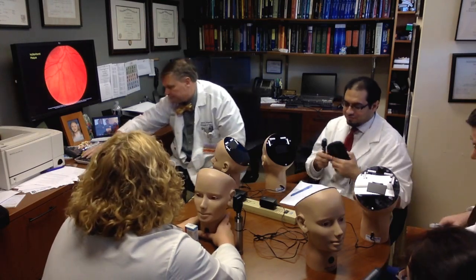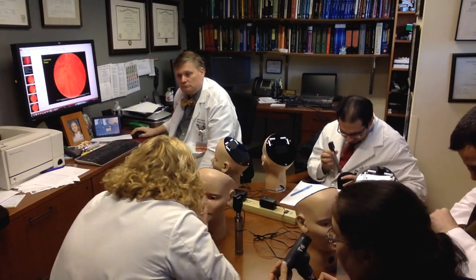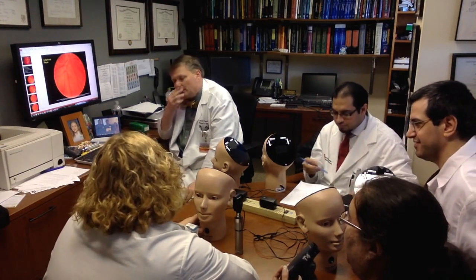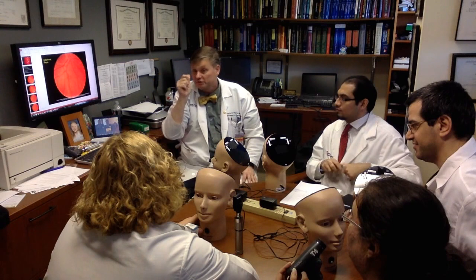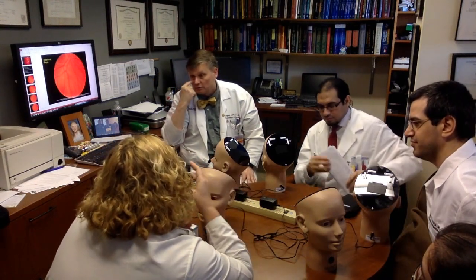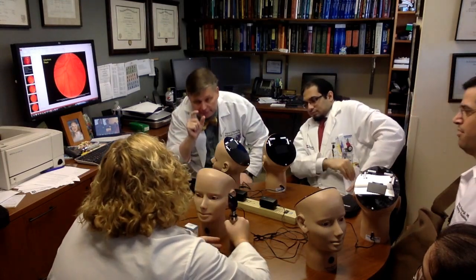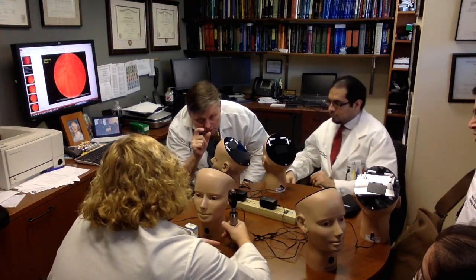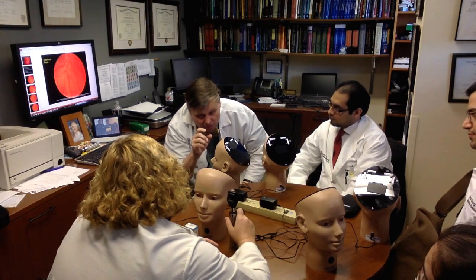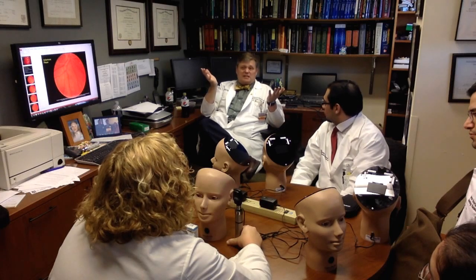My problem is I always see the red reflex, and then I keep going in, and everything's blurry. What am I doing wrong? Well, first of all, definitely focus at a distance. That's really key because I have LASIK, so that'll take care of your refractive error. Number two is that once you get pretty close, then you slowly turn the dial one way or the other and pick something you can focus on, be it a blood vessel or the disc or something. Listen, it's like every skill, it just takes practice.